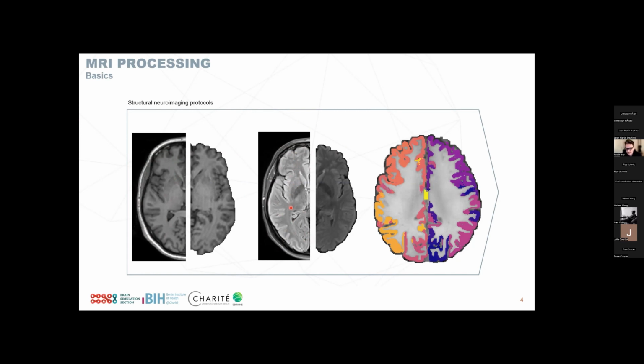This is what differentiates these different MRI modalities. We're always capturing the same brain, but we're capturing different aspects, different biophysical aspects, etc. And even within the anatomical scans, we have these different properties, with the most basic one generally being the T1 image, which gives us a good estimate of the actual structural properties.